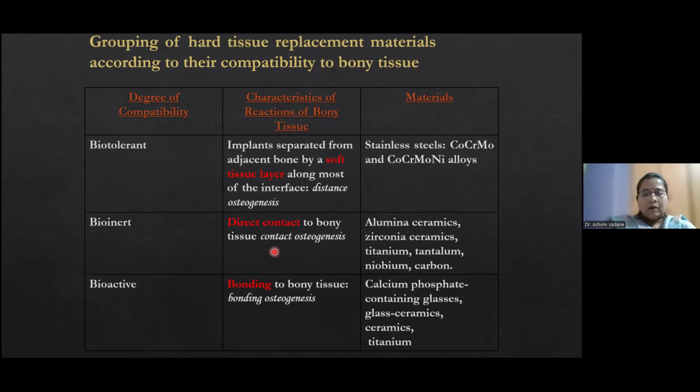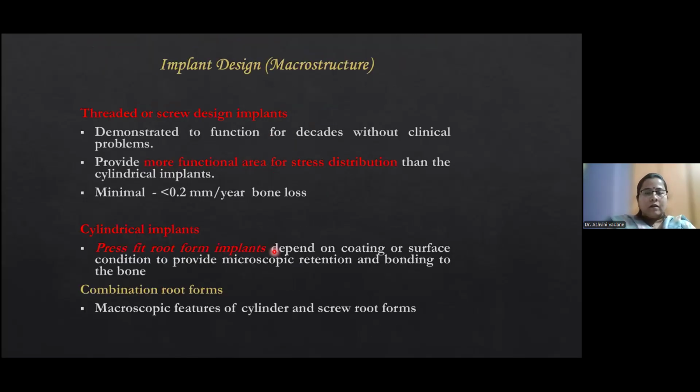I will share this study material with everyone so that they can go through this. Then as we see, implant design, one should take into consideration. So regarding this, threaded or screw design implants are demonstrated to function for decades without any clinical problems. These provide more functional area for the stress distribution. And in these cases, minimal bone loss is seen.